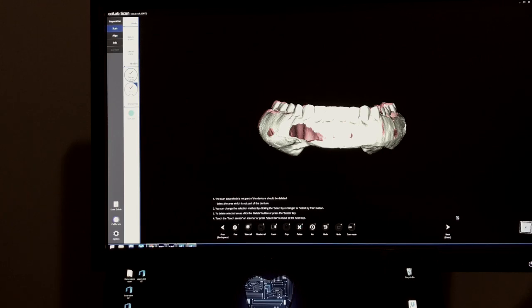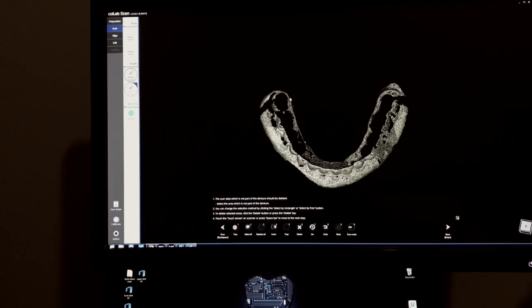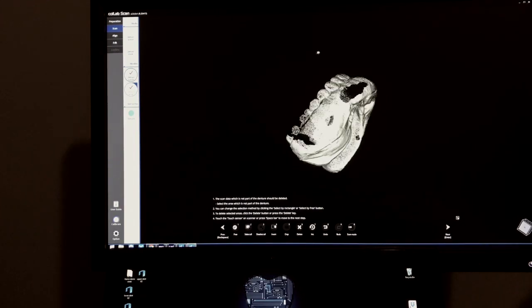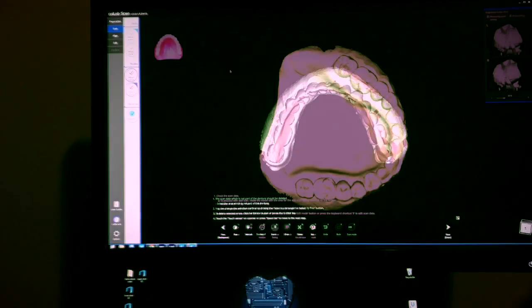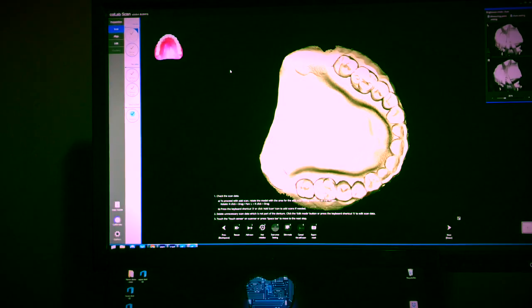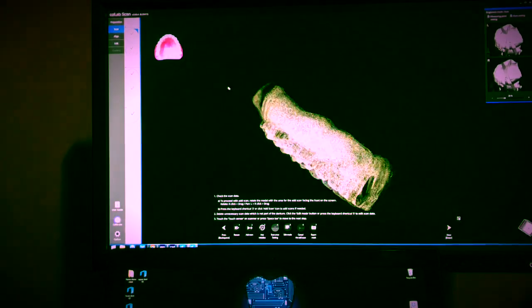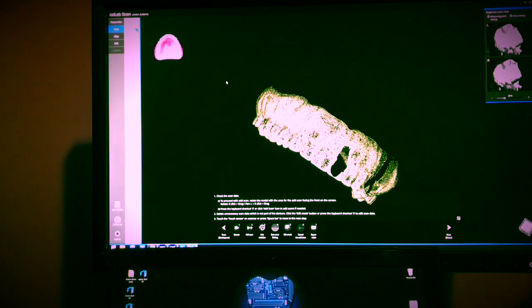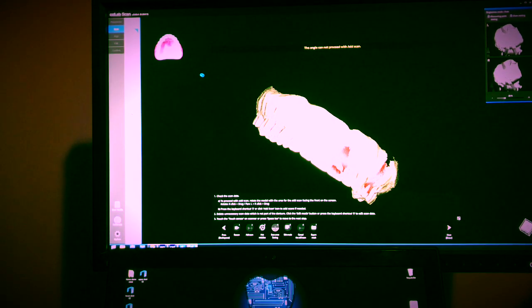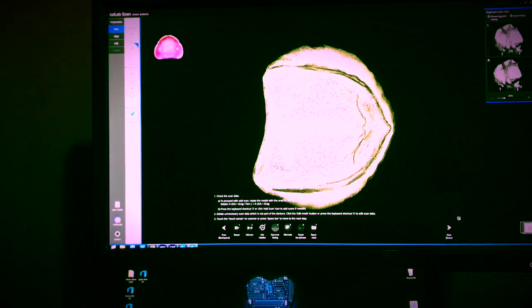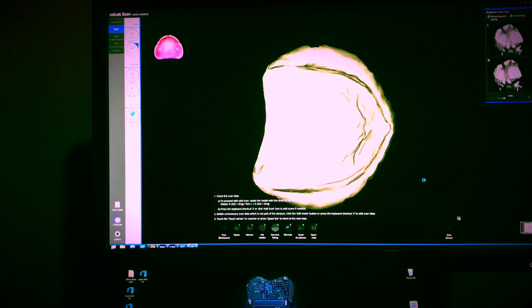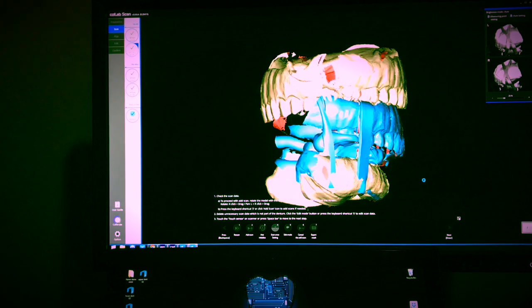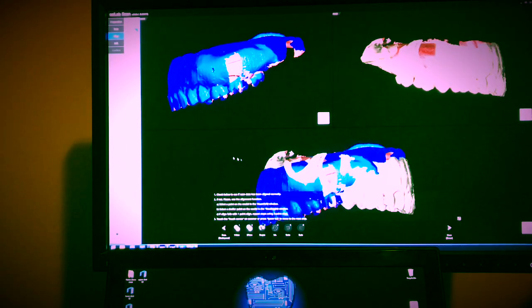This is looking good, maybe a little bit right there. Okay, so now I'm going to scan the upper one, save some time here, and I will show you how to merge it. Now I have the upper denture scanned - this is the outside and I have the inside as well. We're going to do the next step now, which is the alignment. It's pretty easy. I also have the bite, by the way.